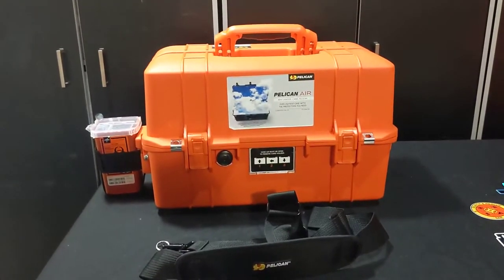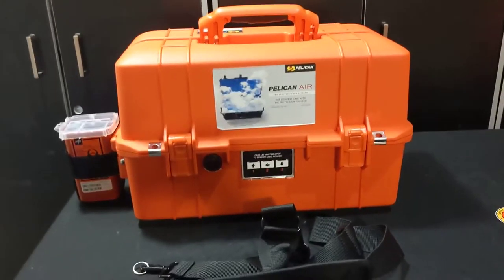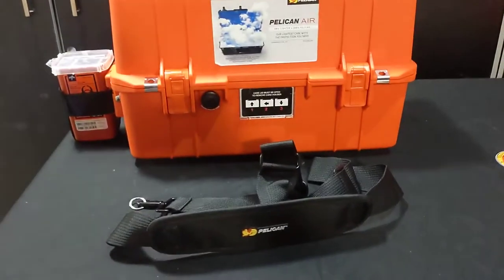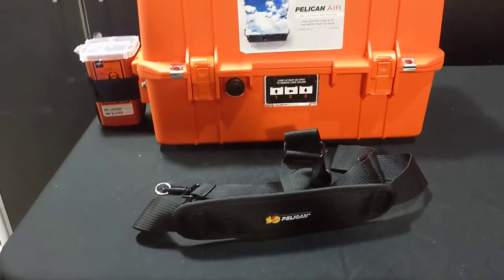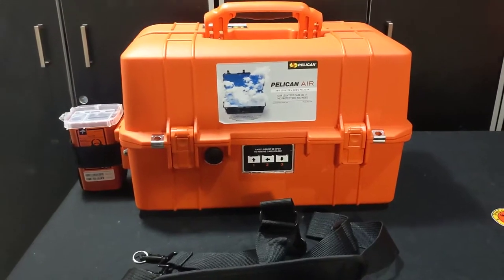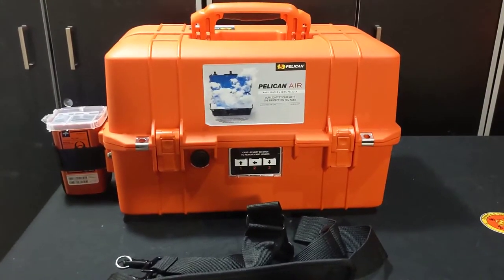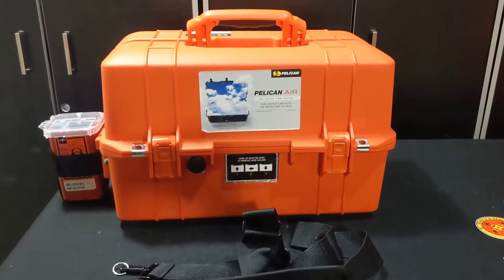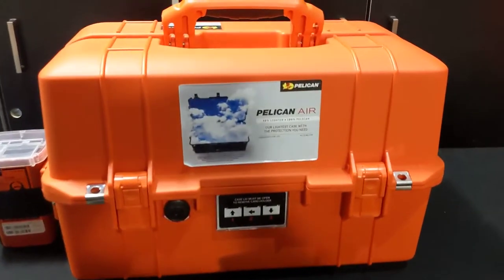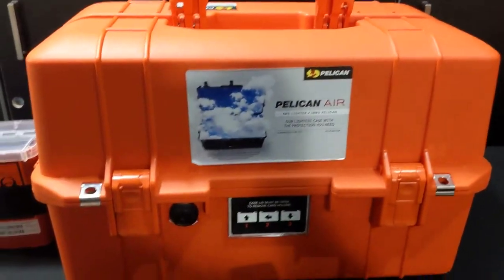This is the Pelican Air 1465, a new version from Pelican. The Air uses a lighter weight resin, so it weighs a little bit less, but still has that same strength, waterproofness, and drop-proofness you're used to. The 1465 Air is the new version of the 1460, and this is a quite long-standing EMS case — it's been used for decades. It's highly reputable, really strong, and durable. It's going to last a lifetime.